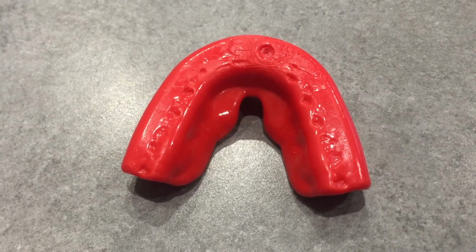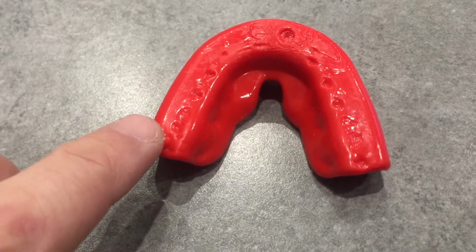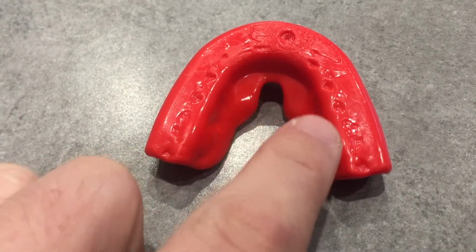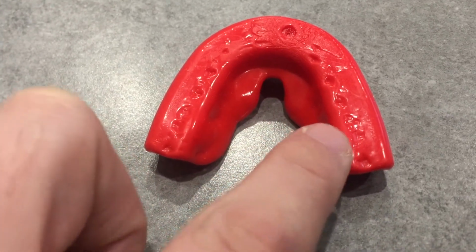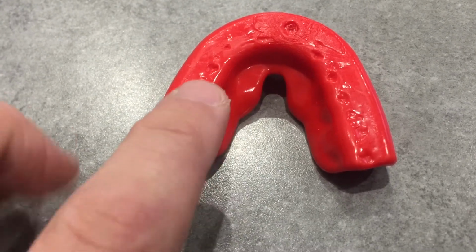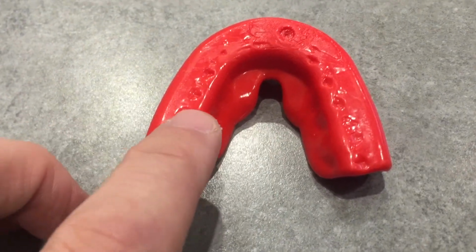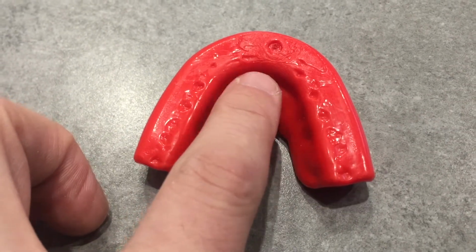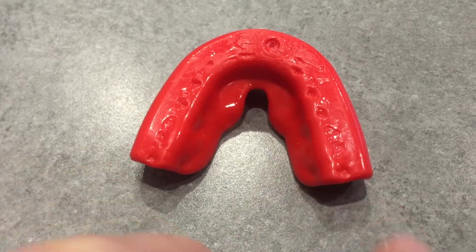Looking at the biting surface of this boil and bite mouthguard, you can see that there are spots where my molars have touched in on either side, not so much near the front, but this is actually a decent indentation for what we want here. We want a place for each of our teeth to fit into comfortably, not get locked in place, but have a seat that's comfortable for each one. I would like to see some more contact anteriorly here, but on the posterior, it's not actually too bad.